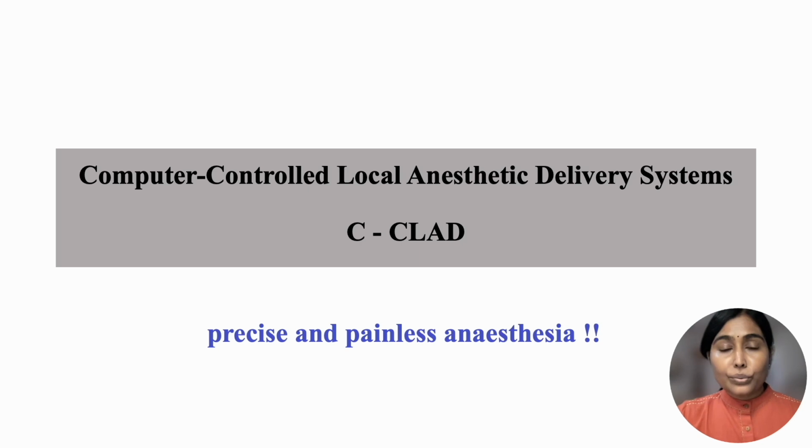We now move on to the more sophisticated form of local anesthetic delivery, a computer-controlled local anesthetic delivery system. This is a computerized device that controls the flow of local anesthetic solution into the body. It's used in dentistry to reduce pain and any kind of discomfort during the procedures.